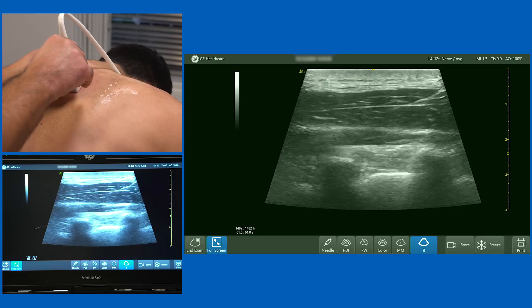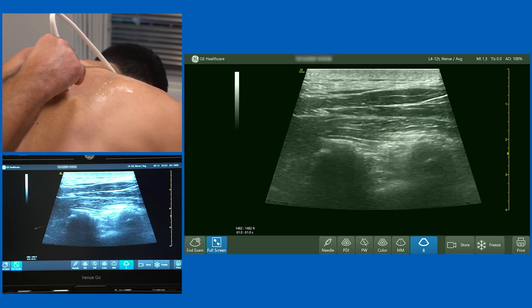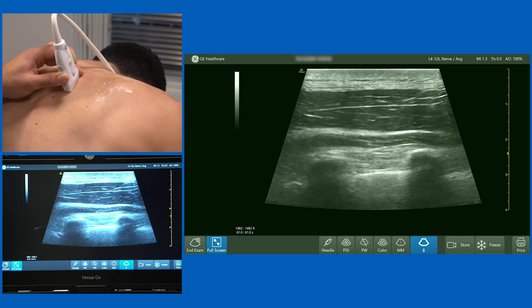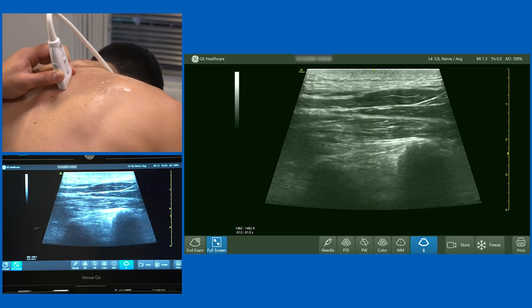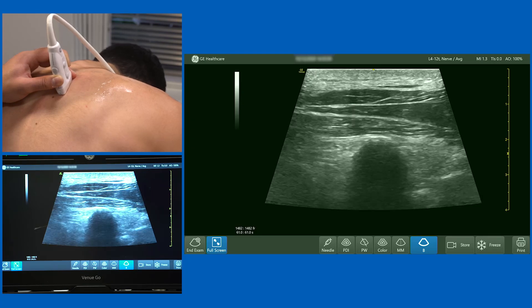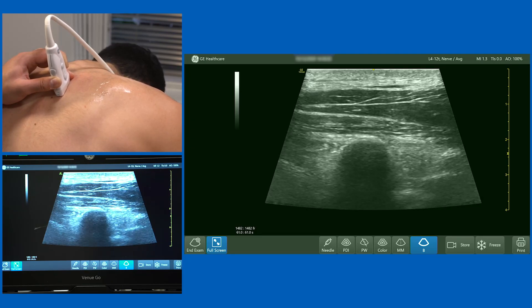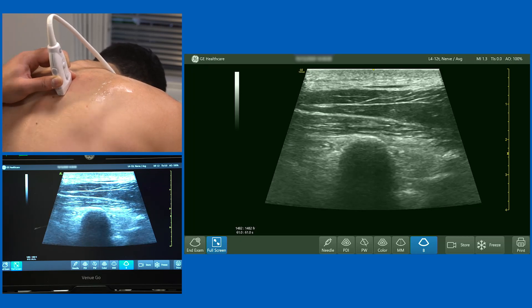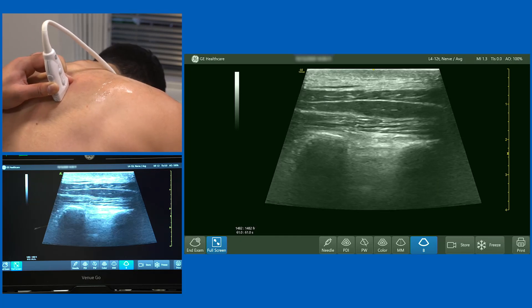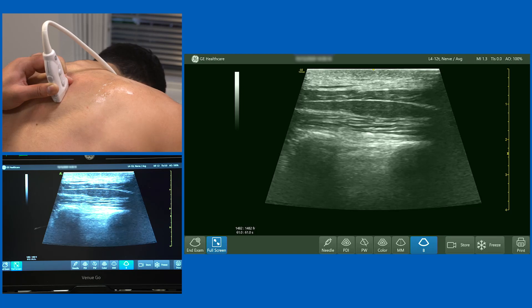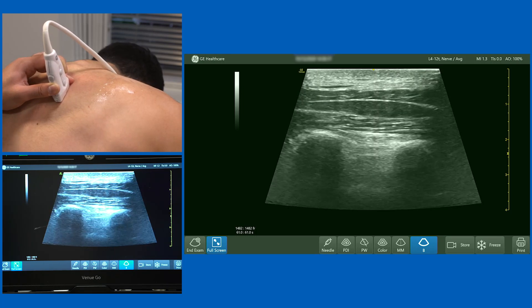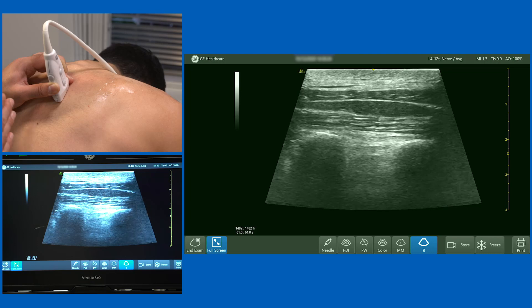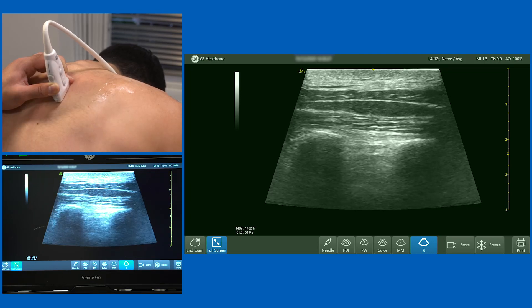The problem with the fascia is it's not a specific thin line — there are multiple components, so sometimes you can end up splitting the fascia. As you scan from ribs towards the transverse process, get a nice view of two transverse processes. Aiming for the corner of the transverse process, you can often lift the muscle off very effectively. If unsure, bring your needle in to make contact with the bone and then withdraw ever so slightly. To perform the erector spinae plane block, inject local anaesthetic between the transverse processes and the erector spinae muscle above — typically 20 to 30 millilitres to achieve hemithoracic analgesia on the side you're blocking.